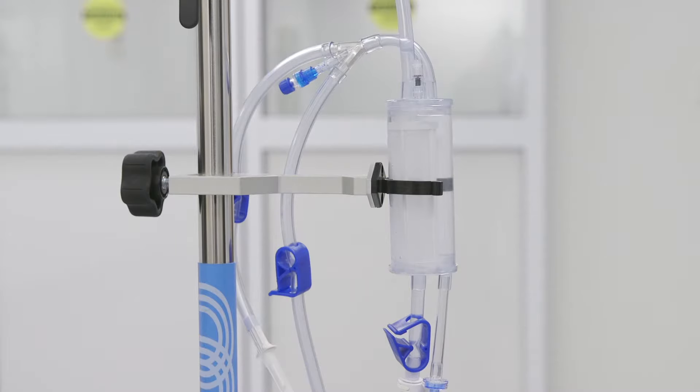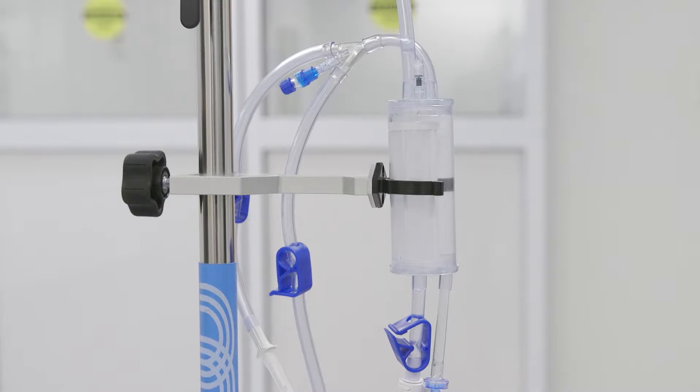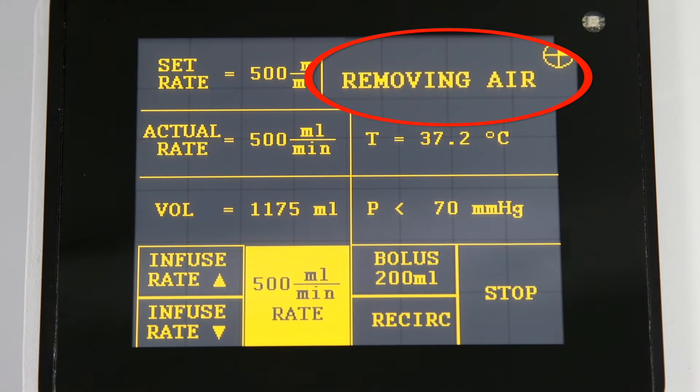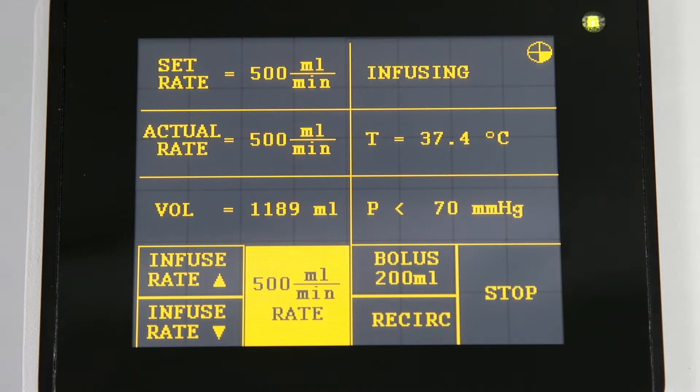As fluids are warmed, gases are formed. The Belmont Rapid Infuser RI2 will trap these gases within the system and automatically purge them into the atmosphere. When this occurs, 'removing air' will be briefly displayed on the screen and you may see bubbles escape through the recirculation or vent line.